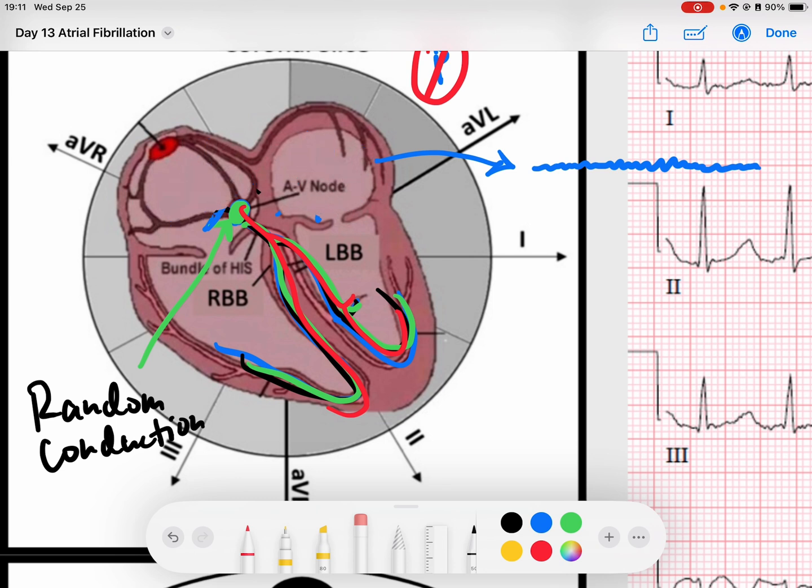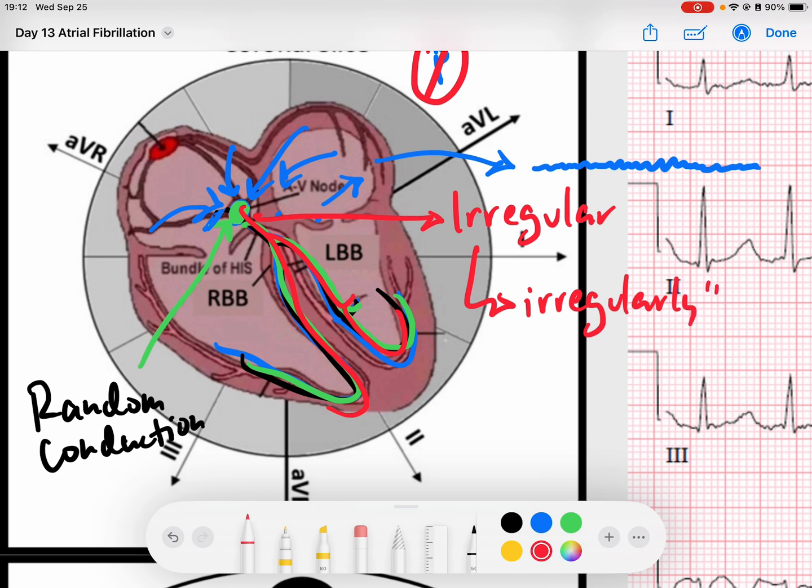But in AFib, what ends up happening is the AV node is just constantly getting bombarded with these fibrillatory waves and it can't always send them down, but it can every so often. We end up getting random conduction to the ventricles and that creates a rhythm, a QRS complex that is very irregular. It is so irregular to the point that we actually call it irregularly irregular, meaning that there's no pattern.